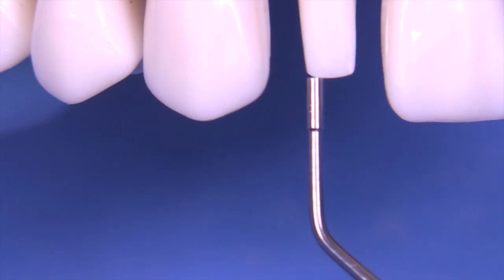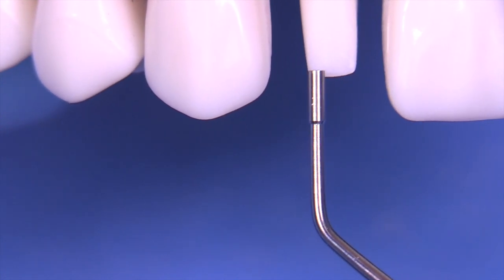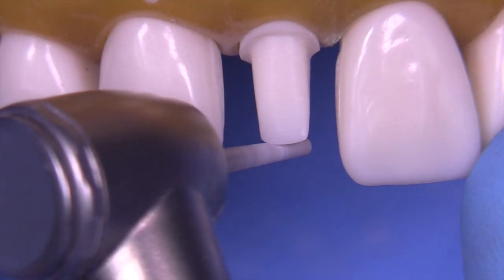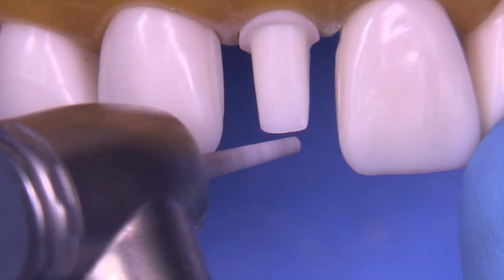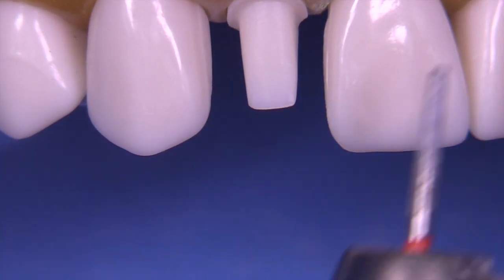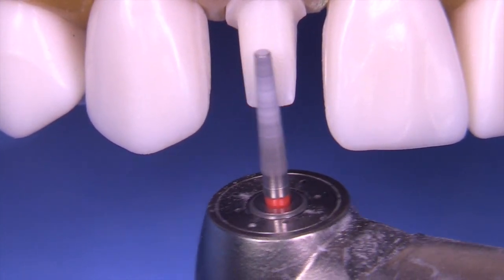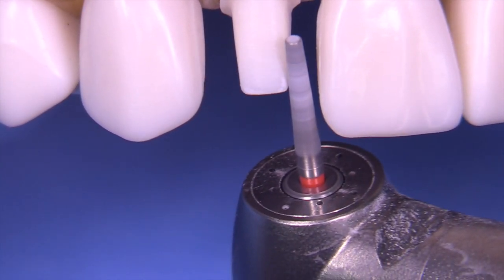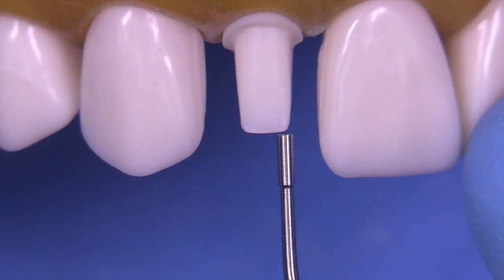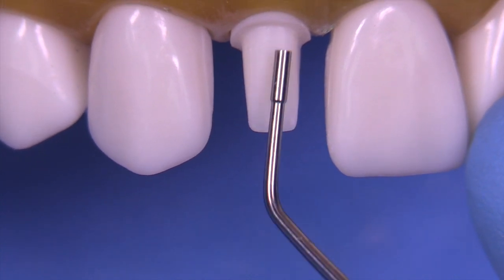The incisal edge correction needs just a little bit more — it's ever so slightly too long — so we can use the finishing diamond very carefully to get that length exactly where we want it. Then finesse the corners and make sure they're nice and smooth. I think that's probably about where I want to keep this preparation.